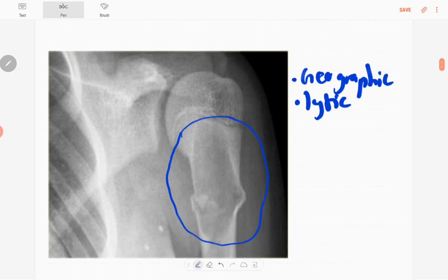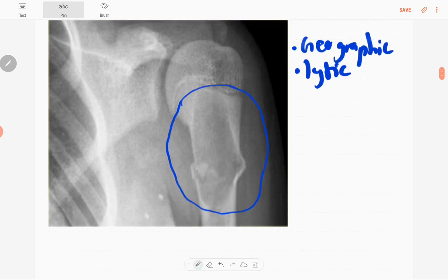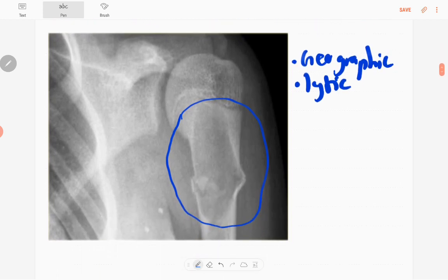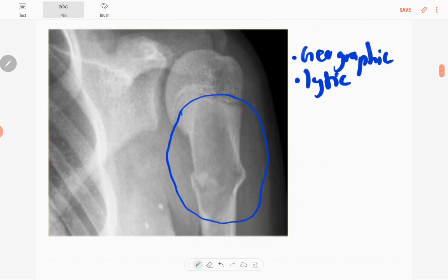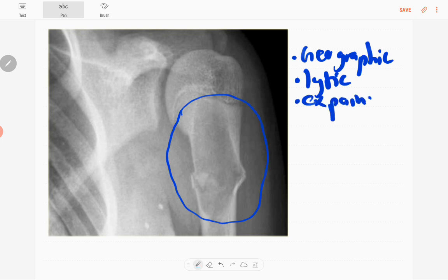There is extension into the metadiaphyseal region as well. It has a narrow zone of transition, slight expansion of the bone, and also a thin sclerotic margin.